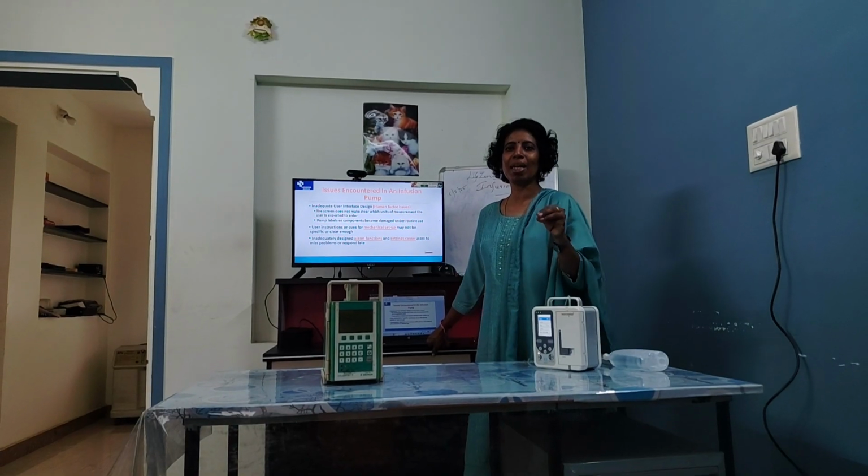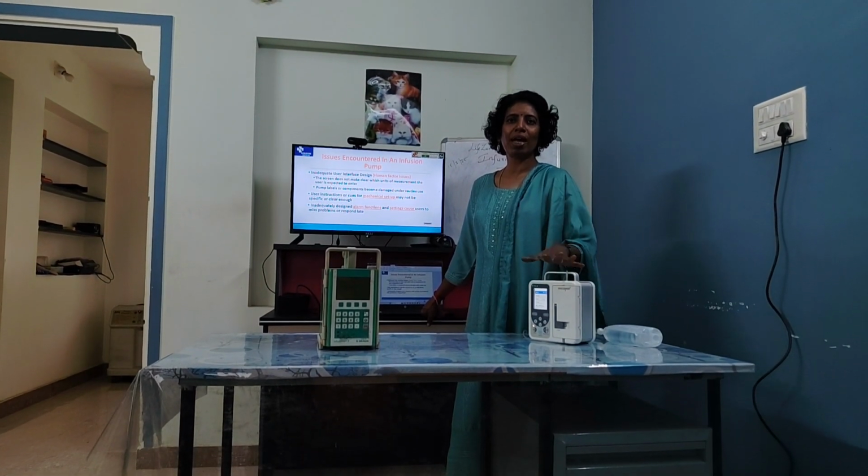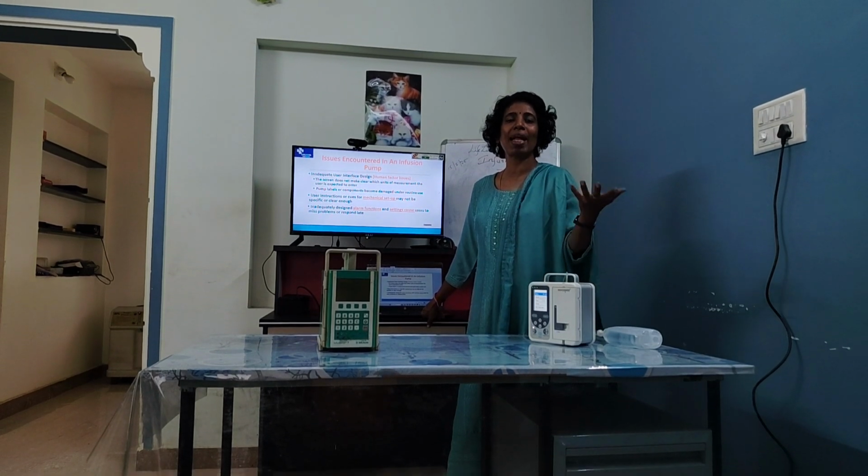There may be inadequate instructions provided in the manual to set the alarm. So if there was an issue, that issue may not be brought to the notice of the health professional.